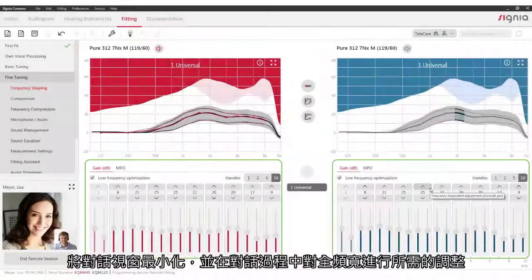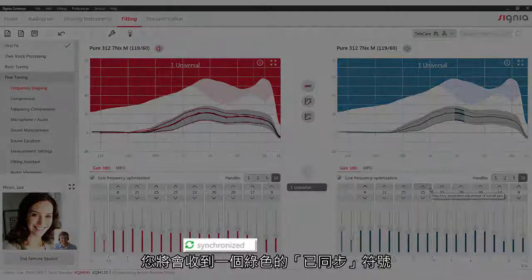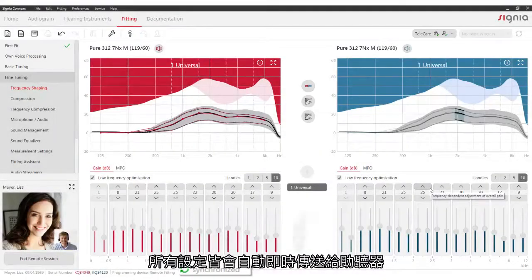Minimize the call window and make the desired adjustments on full bandwidth during the call. As soon as the changes have been transferred successfully, you will be informed via the green synchronized icon. The adjustments will be sent to the hearing aids automatically and in real time.